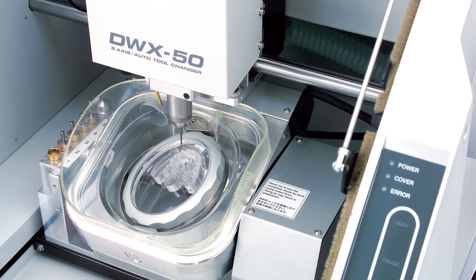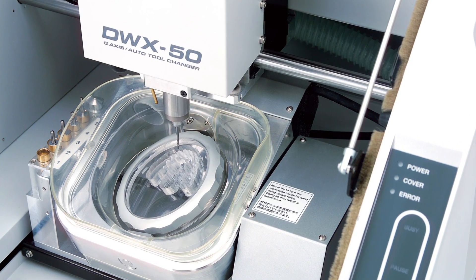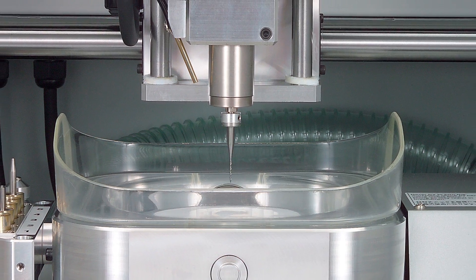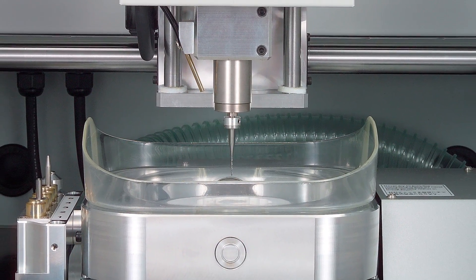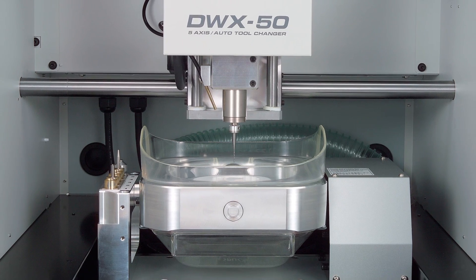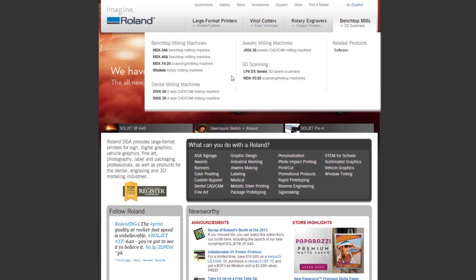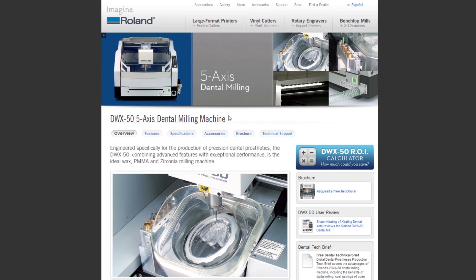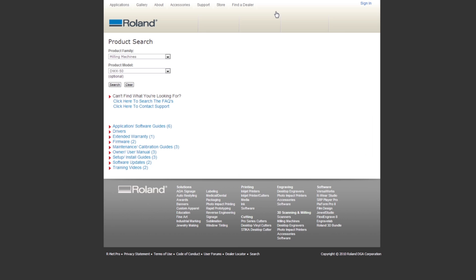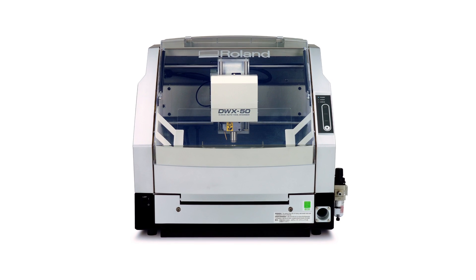Once you have completed all the items on the checklist, you should be ready to mill your next job. By cleaning the mill on a regular basis, you will obtain the best results possible while extending the life of your mill for many years to come. For more detailed information on cleaning, calibrating, and periodic maintenance, please visit our website. The many resources and tips and tricks offered will help keep your Roland DWX50 the best performing machine in your lab or office.